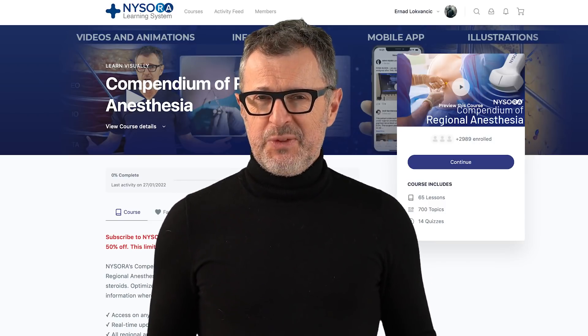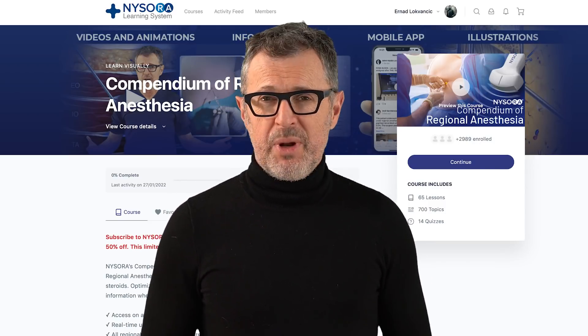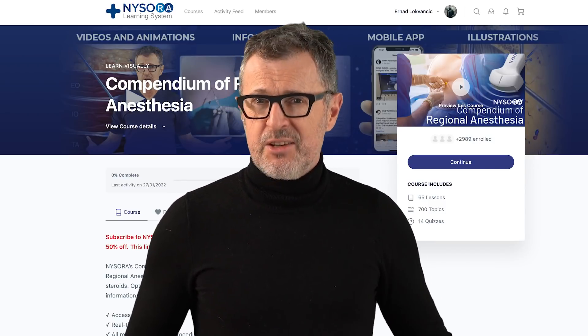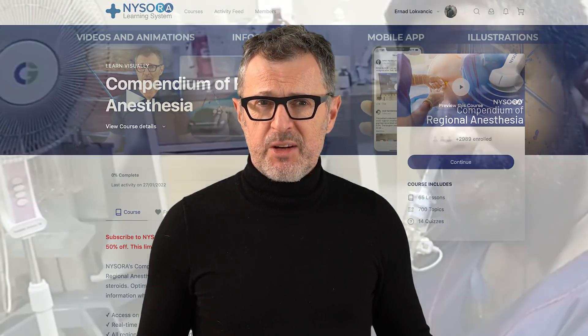Greetings. In this video, we will demonstrate the technique of blind nasal intubation. Dr. Janil MacLean will demonstrate the step-by-step approach to this technique while self-intubating.